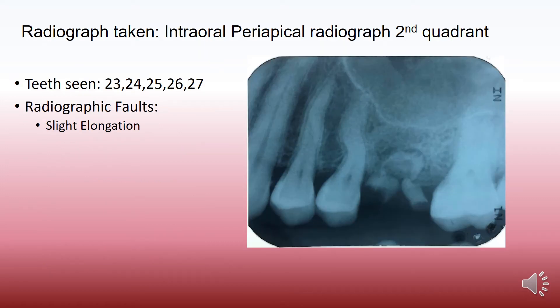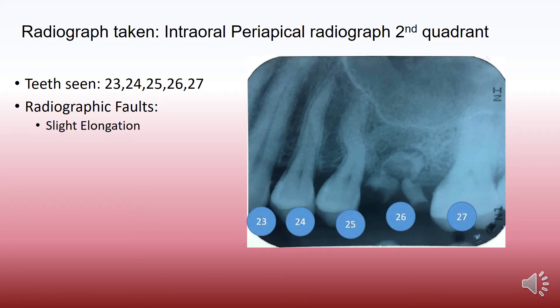The radiograph taken and the one which we are discussing today is an intra-oral periapical radiograph of the second quadrant. The teeth seen are 2-3, 2-4, 2-5, 2-6, and 2-7.